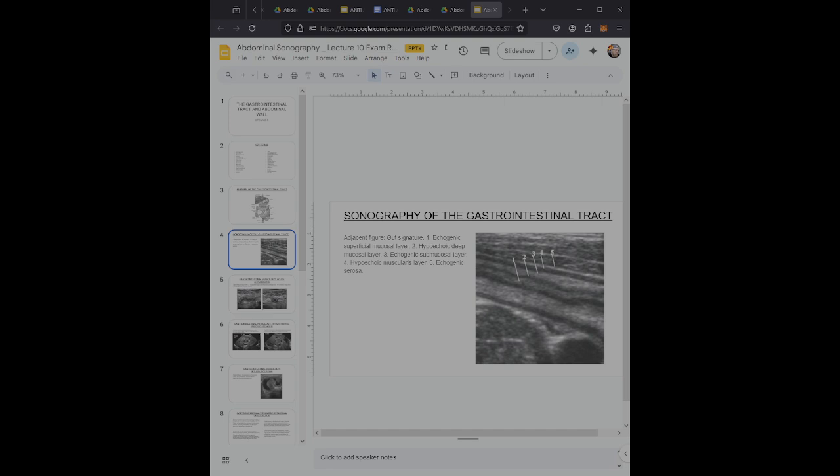The sonographic examination of the GIT should include graded compression or compression sonography to differentiate normal from anomalous bowel. Specifically, normal bowel should be compressible and should show observable peristalsis. Compression of the bowel will also move intraluminal fluid and or gas out of the area of interest. Generally, the normal intestinal wall should measure less than 5 millimeters in thickness, and a normal bowel wall segment produces little to no color Doppler. Consequently, color Doppler can be beneficial to examine inflammatory changes.